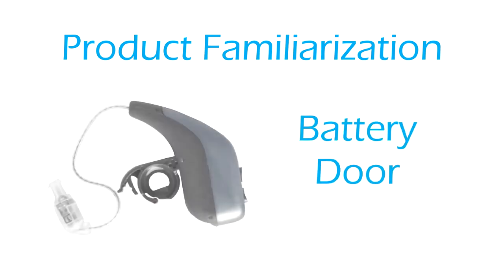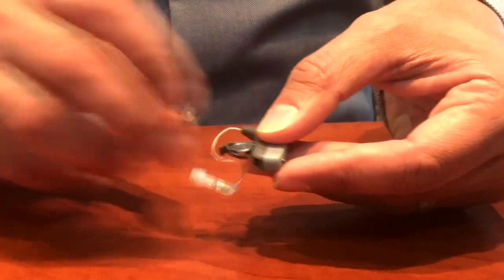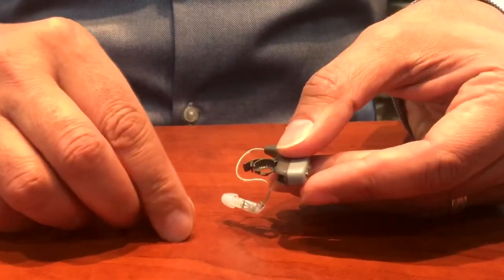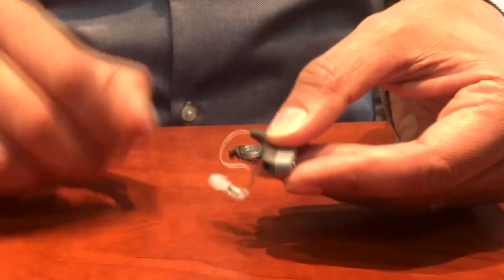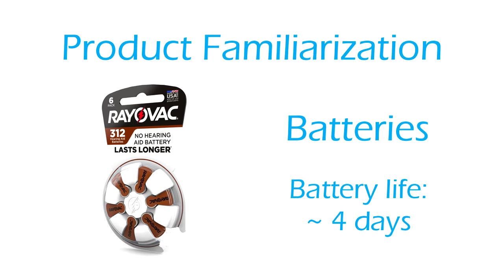Battery door is located on the bottom of the HD75 hearing device. Use your finger to open the door. Insert the battery, then close the door until completely closed. The positive side of the battery should face up while the negative side should insert into the door. The HD75 uses a disposable size 312 zinc air battery.